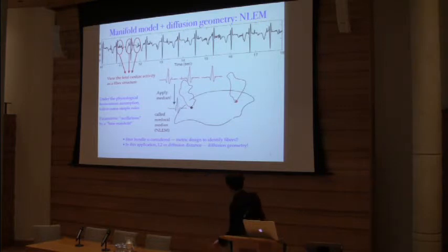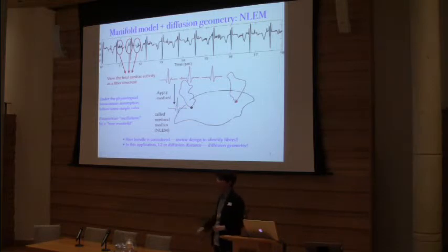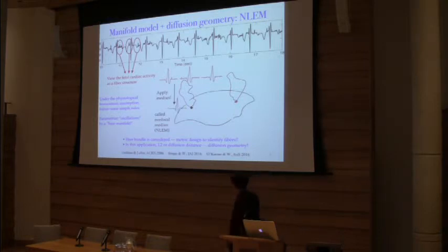I won't discuss it here because it may take me 30 minutes to describe in detail. But just keep in mind that I have a low-dimensional structure and I run some kind of diffusion process on it. After running this diffusion process, I can determine the neighbors. Those neighbors will share the same maternal ECG, so I can run the median and get the maternal ECG. Do the subtraction, and get the fetal ECG.